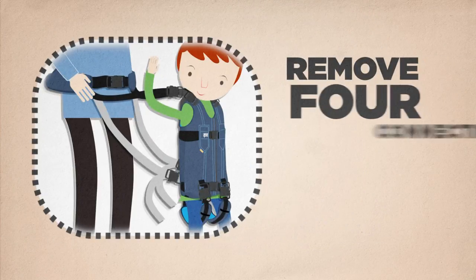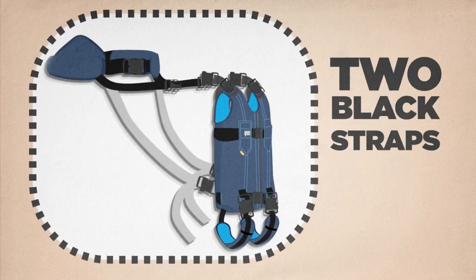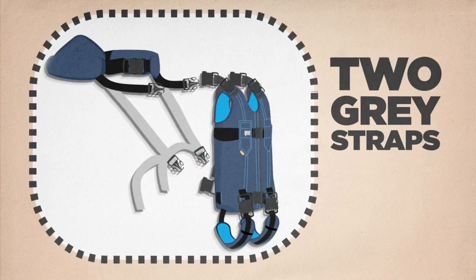Remove all four connecting straps from your child's harness — two black at the shoulders and two grey at the lower back.